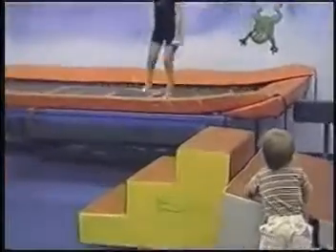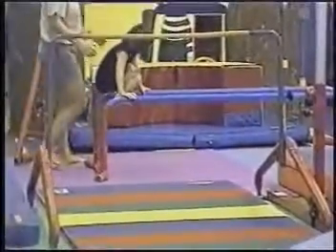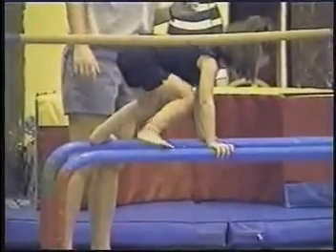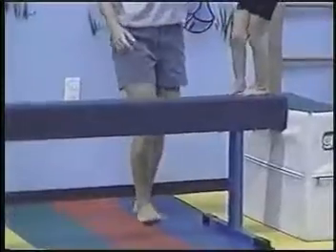At 14 months of age, Isabella walks well. Her feet are functionally normal. To prevent a relapse, she wears the abduction brace at night. At three years of age, Isabella jumps on the trampoline. She easily crawls on the parallel bars, and she dances gracefully on the balance beam.